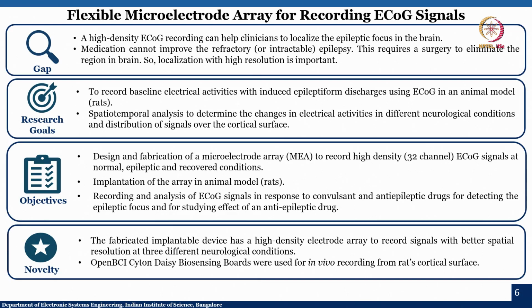What are the research goals? If you want to pursue research in this domain and the objective is to create a microelectrode array with high density electrodes, then the first goal should be to record the baseline of electrical activity, with induced epileptiform discharges, using ECoG in animal models. Then a spatiotemporal analysis to determine the changes in the electrical activities in different neurological conditions and the distribution of the signals over the cortical surface.